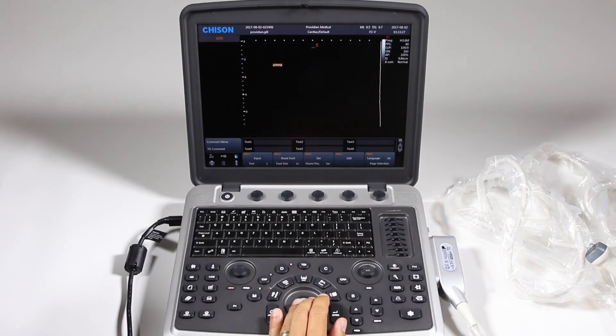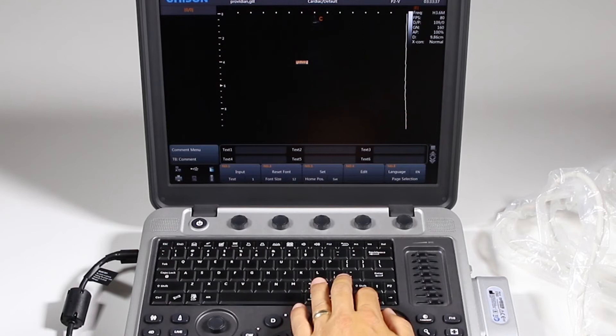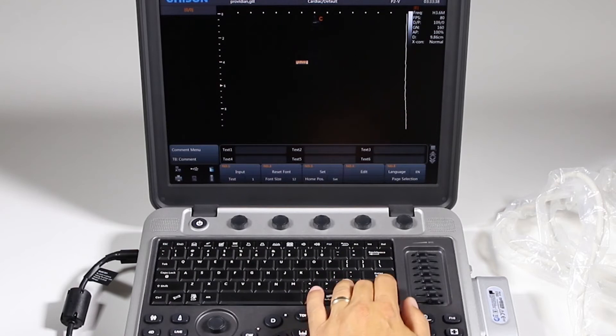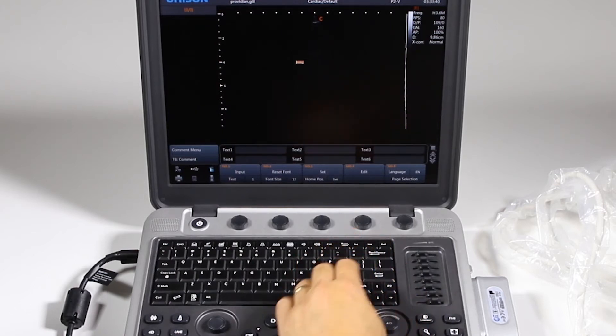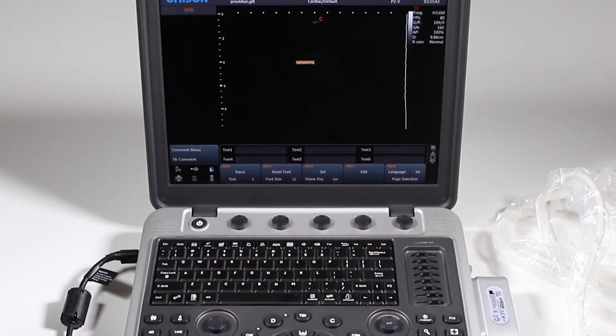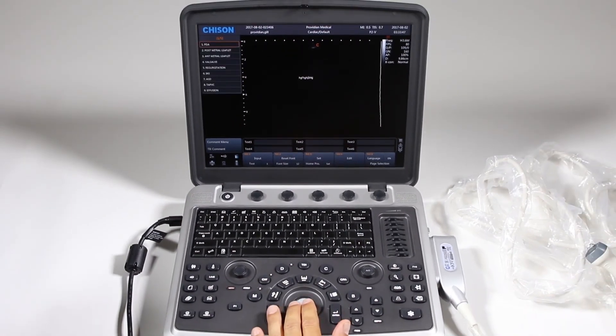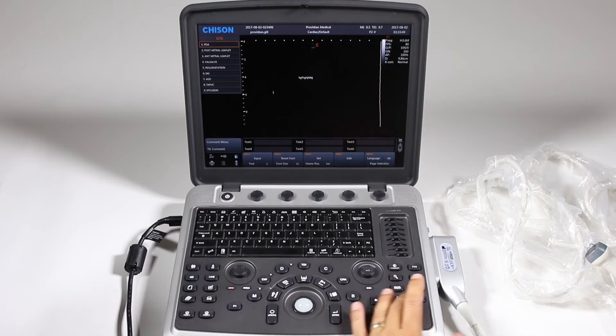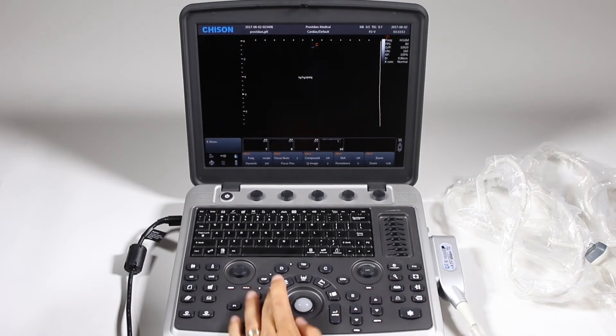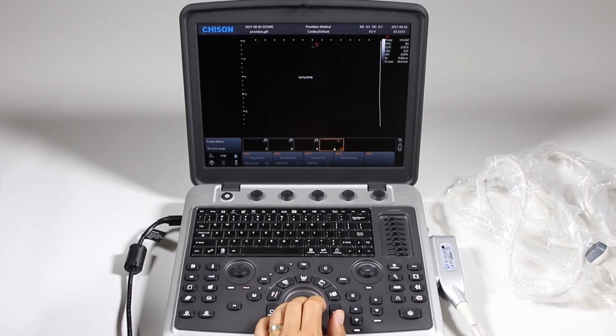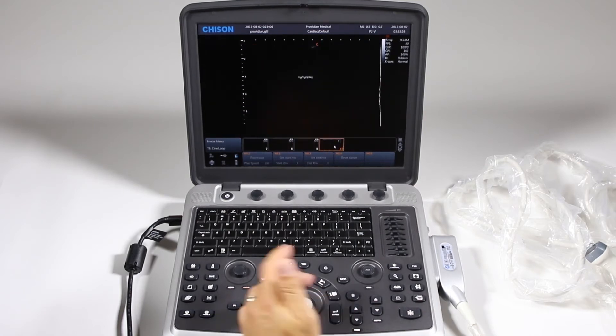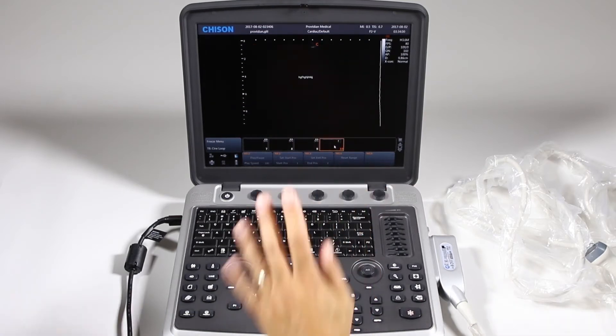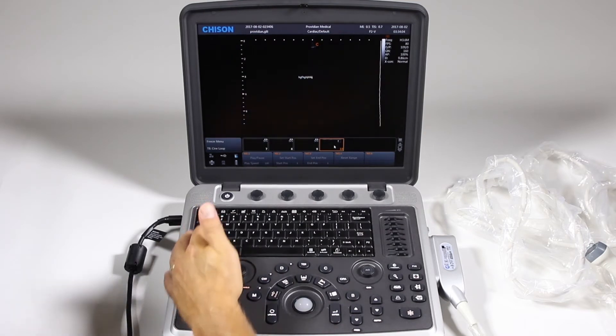Now if I want to go back and change a previous comment, take that, click the arrow keys, backspace, and I can type over that. Make sure you click enter, so make sure it's white before you do anything because if you save it while it's yellow, that text will not show up on the screen. If I go back and review it, that text is there on screen. If I don't hit that enter key, that will not be saved on your image.